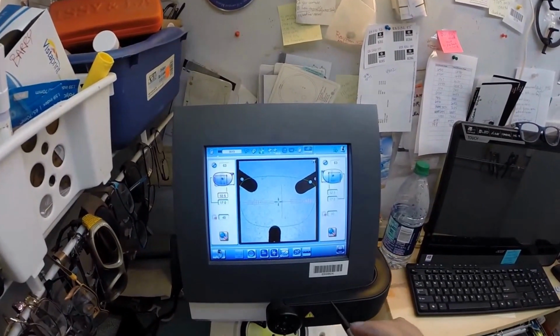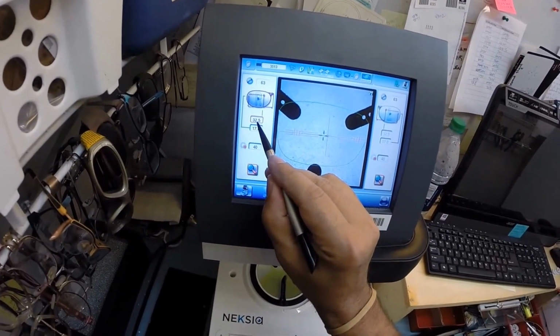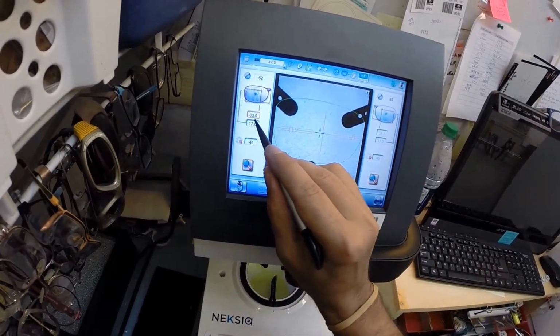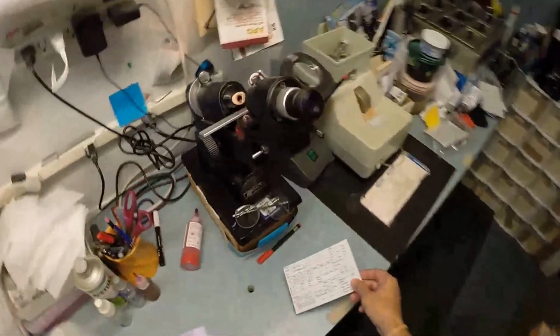Now your pupillary distance is 67, which is 33.5 in both eyes. My computer starts at 32.5. I'm going to hit this little plus emblem twice because it goes up in half millimeter increments. We're at 33. Now we're at 33.5. So that's ready. Let's go ahead and get your lenses prepped.